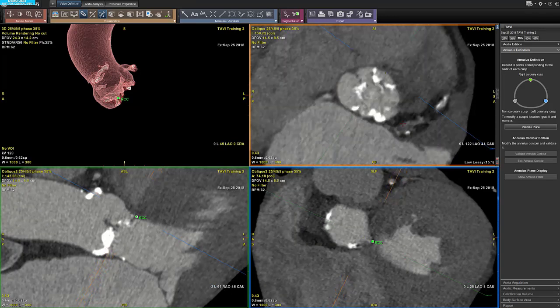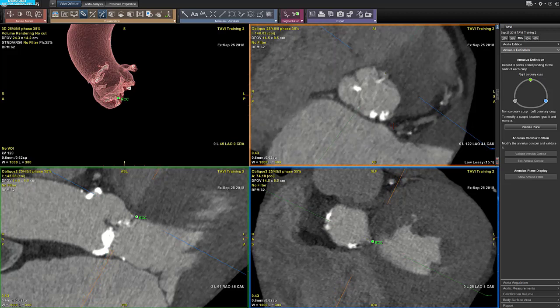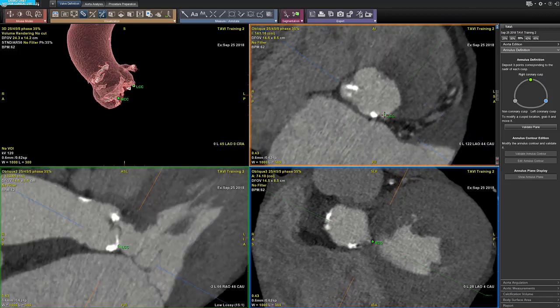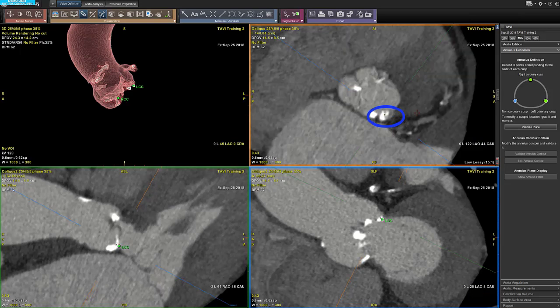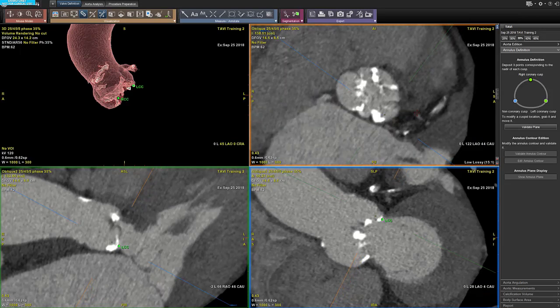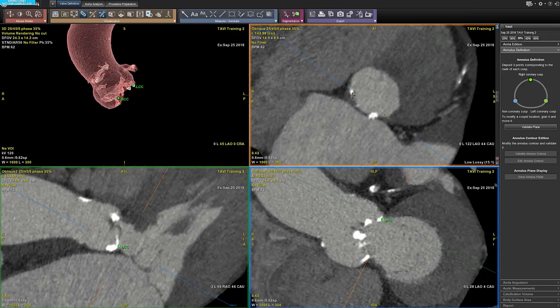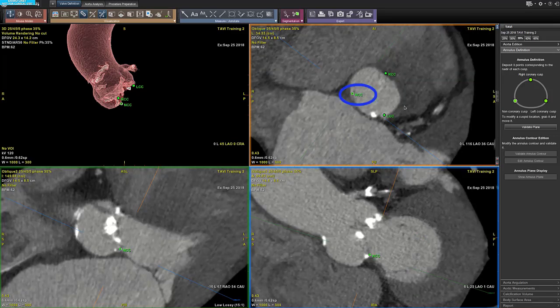The software will automatically select the left coronary cusp. You deposit the point on the left coronary cusp, and the software will automatically select the non-coronary cusp. The three points are now deposited to define the annulus plane.